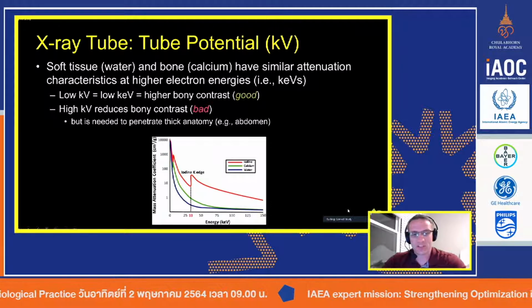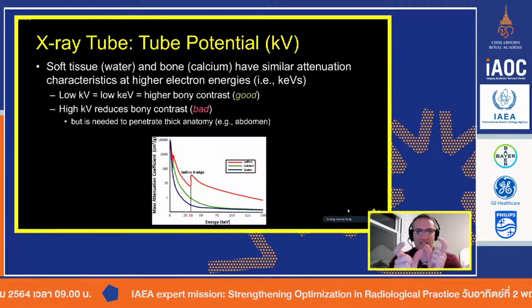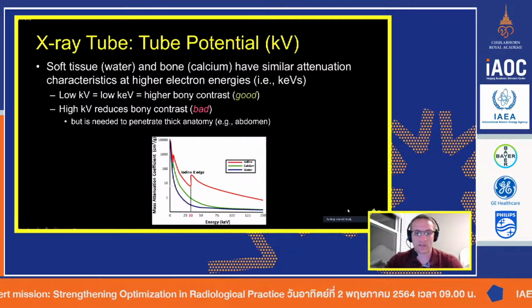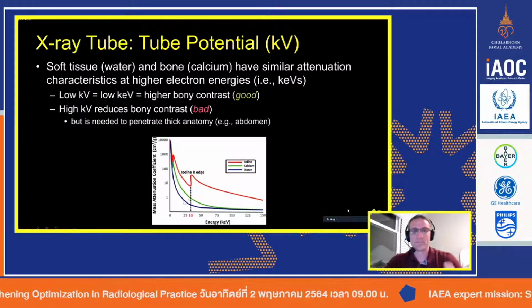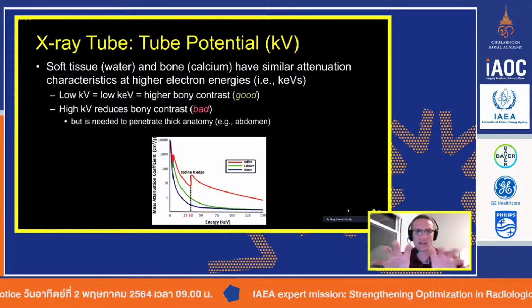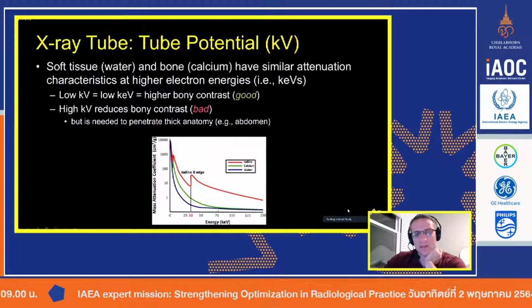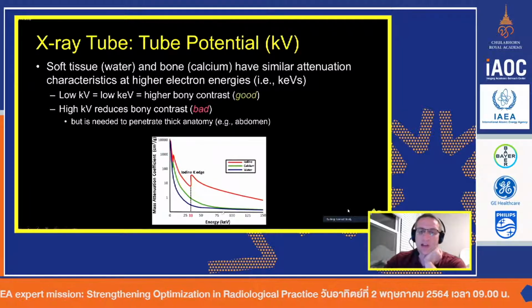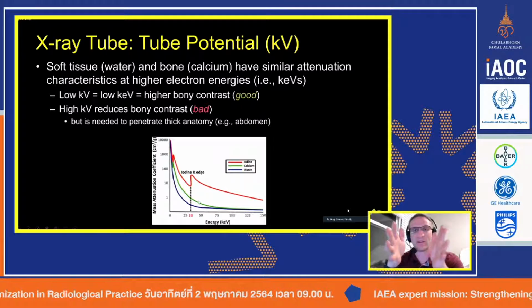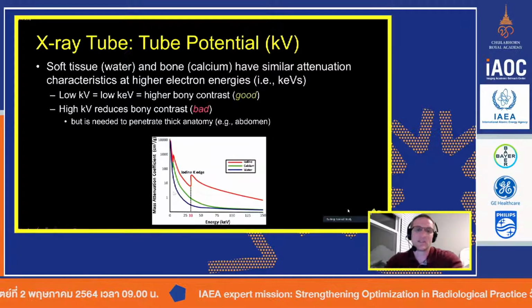Where there is the greatest difference between these curves, those objects will appear the most distinct in the X-ray, in the actual radiograph. So if we're imaging at relatively low energies, low kVs, the bony anatomy in the soft tissue will look very distinct, grays versus whites. The higher the kV, you can see these curves come together and overlap. So the higher the energy that we dial in, the higher the kV setting, the less distinct the bony anatomy and soft tissue will be. They will become more and more the same grayscale value. So this is a bad thing.